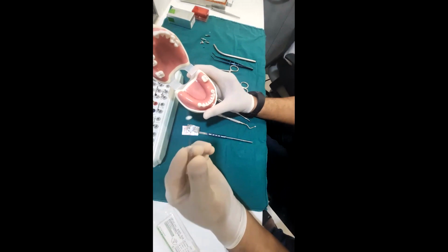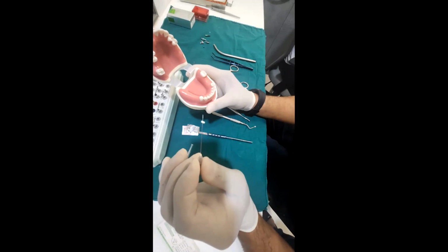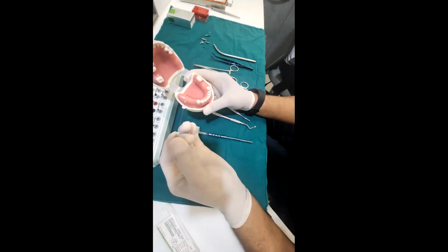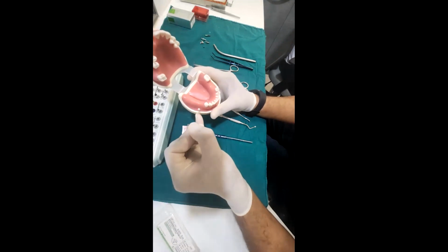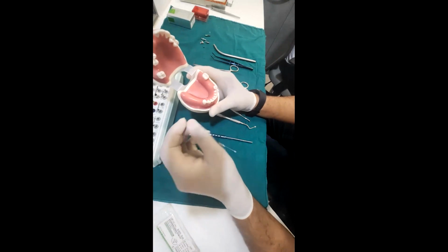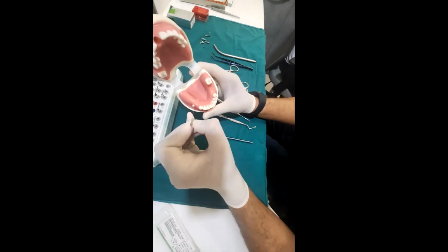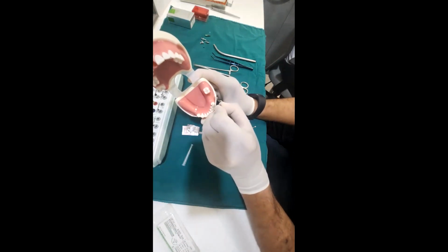There is something else that I used to do to begin with, called bone mapping, where what we need is just a simple anesthesia needle and a rubber stopper which comes along with any root canal hand instrument that we use. What you need to do is just try and feel the bone and see what length or depth you have reached to hit the bone. And that is how you can do a three-dimensional bone mapping as well.